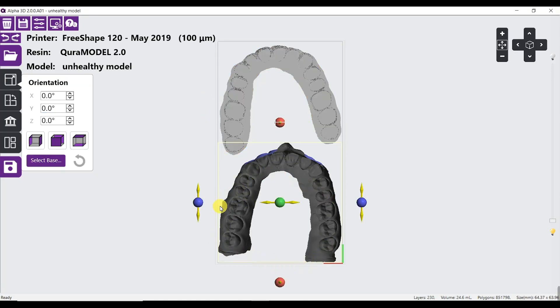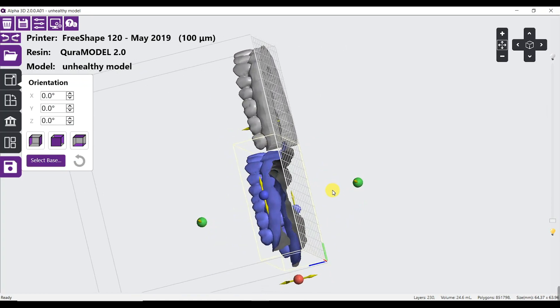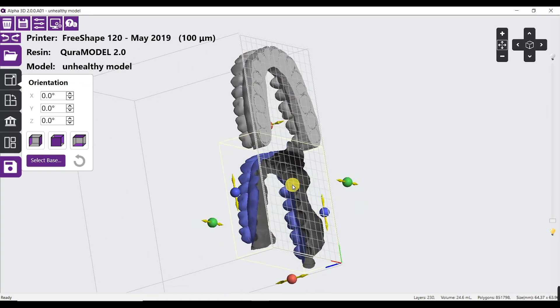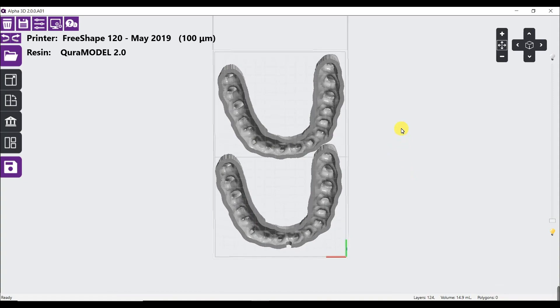An unhealthy model will be shown in blue colors — that's the one at the bottom — and its bottom surface will be rough. I will check if the model is hollow; if it is hollow, I will check if it has a weep hole.